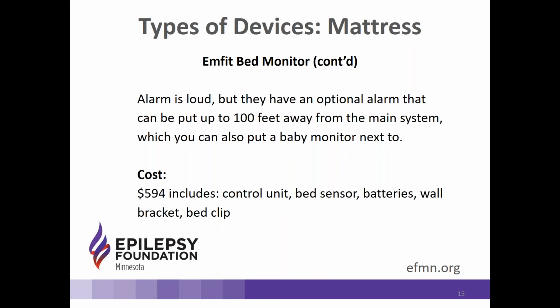Put the alarm in a different part of the house up to 100 feet away, and then you can put a baby monitor next to it so that you listen to the baby monitor to hear the alarm.